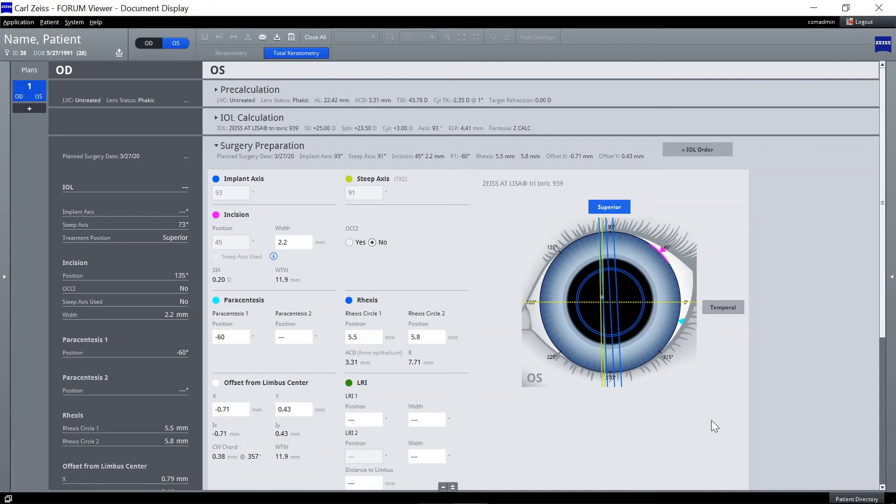Review your surgical assistant parameters for Zeiss Callisto Eye as preset in your user settings and adjust where necessary.